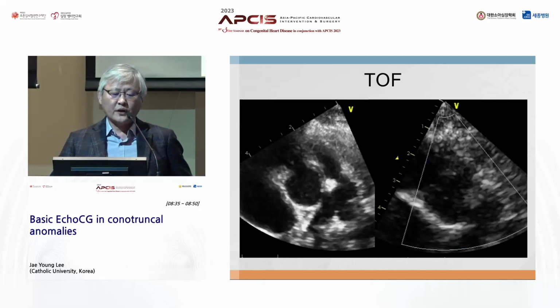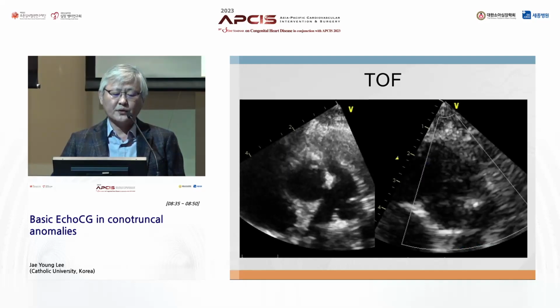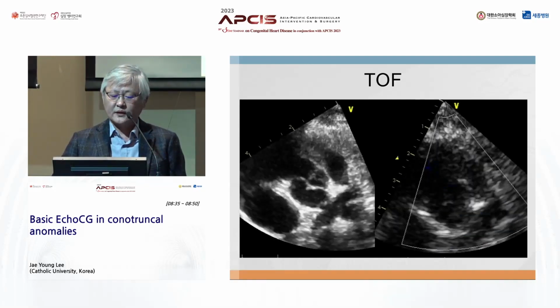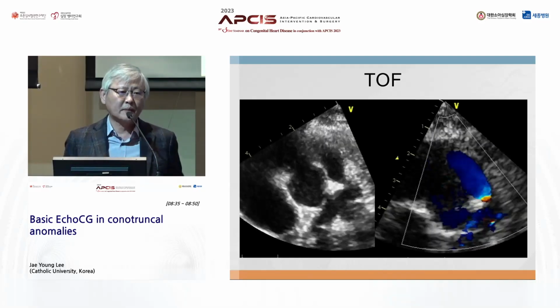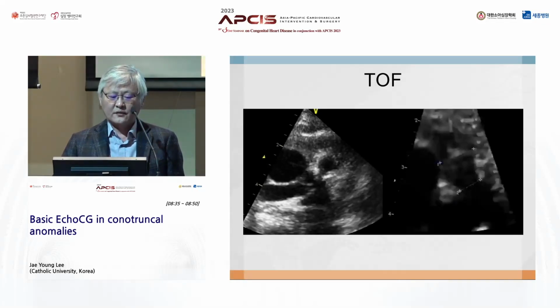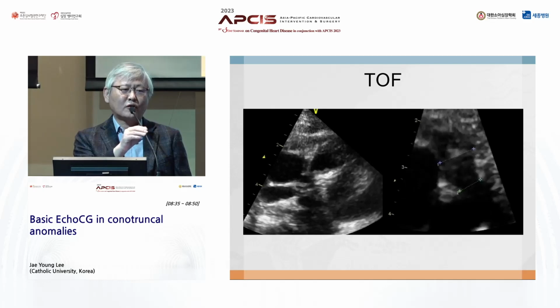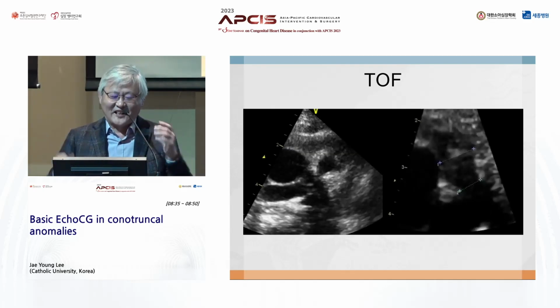And the outflow tract parasternal short axis view also shows the deviated conal septum, squeezed outflow tract, small pulmonary artery, and in this case, supravalvular stenosis also. So outflow tract anatomy and pulmonary system anatomy is very important in tetralogy. You can try to define the pulmonary valve morphology, but it's not easy. So don't waste too much time. The surgeon will not notice them.